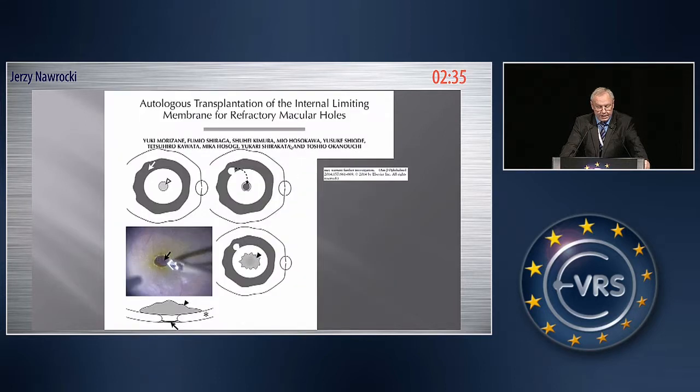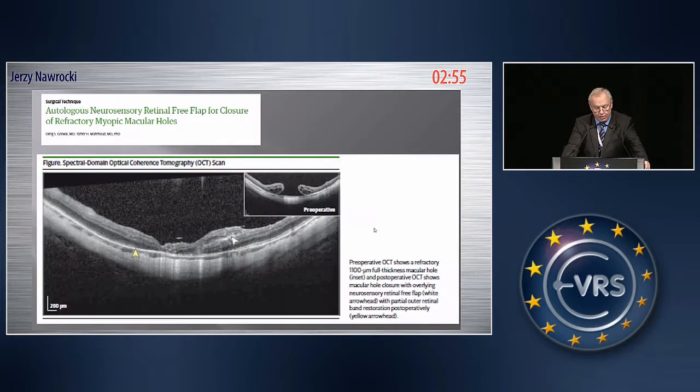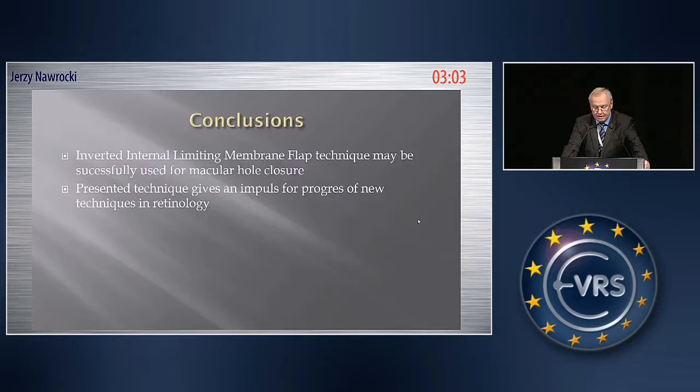Another interesting technique, for those who still do not believe in inverted flap, is autologous transplantation of internal limiting membrane presented by Morizane and co-workers, but this technique is useful for those cases where the ILM was already peeled and we have no closure of the macular hole. And finally, the idea of Tamer Mahmoud, autologous neurosensory retinal free flap, which was discussed yesterday.